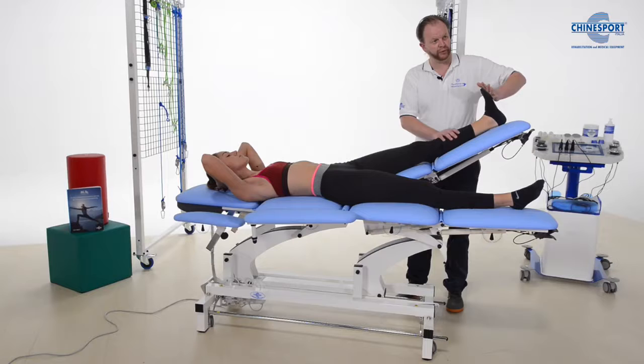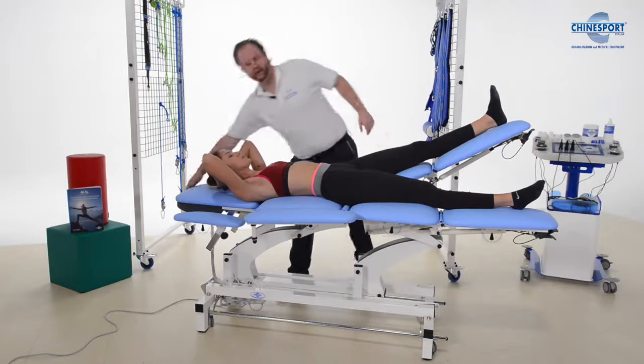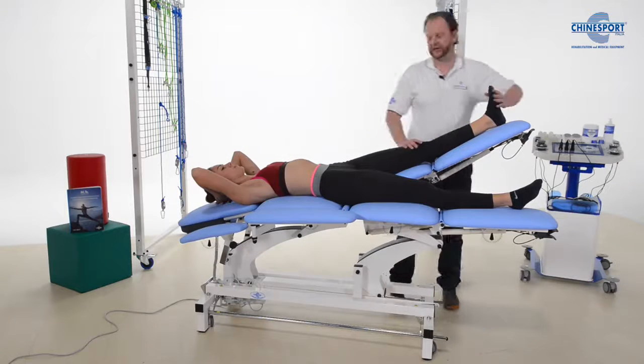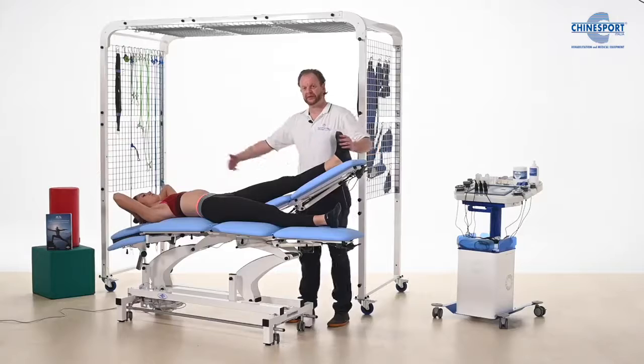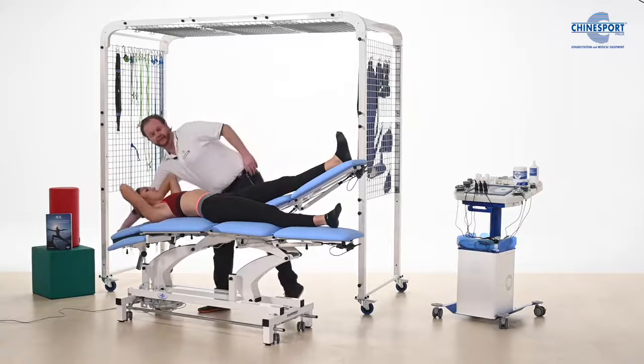We can put some rotation into the hip as well, or we can lower the head section in order to have an increased range of motion so that we can slide and tension the neural structures better.